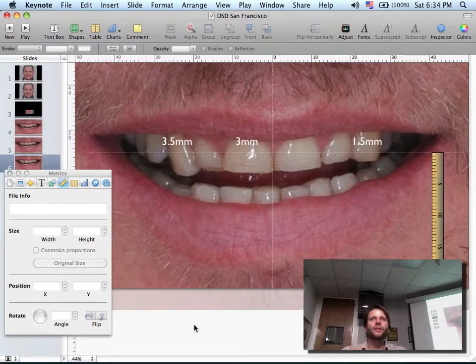So on the mounting plate, the wax up is working as a wax rim if we were doing a denture. If you're doing a denture, you need to fit the wax rim on the upper model, and then you mount on top of the mounting plate. Here we are doing the same. We level the occlusal plane with the buccal of the anteriors with the wax up, and then you position on top of the mounting plate, mount this model against the upper arm of the articulator, and then remove the mounting plate and mount the lower model against it.